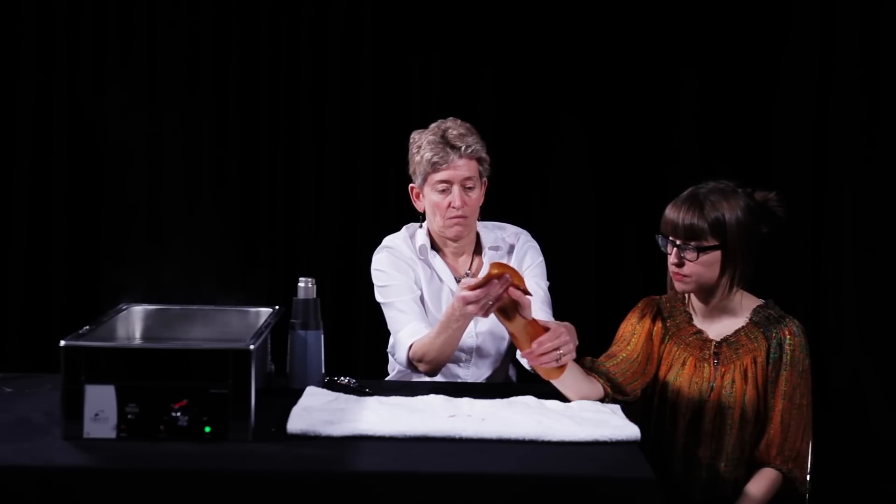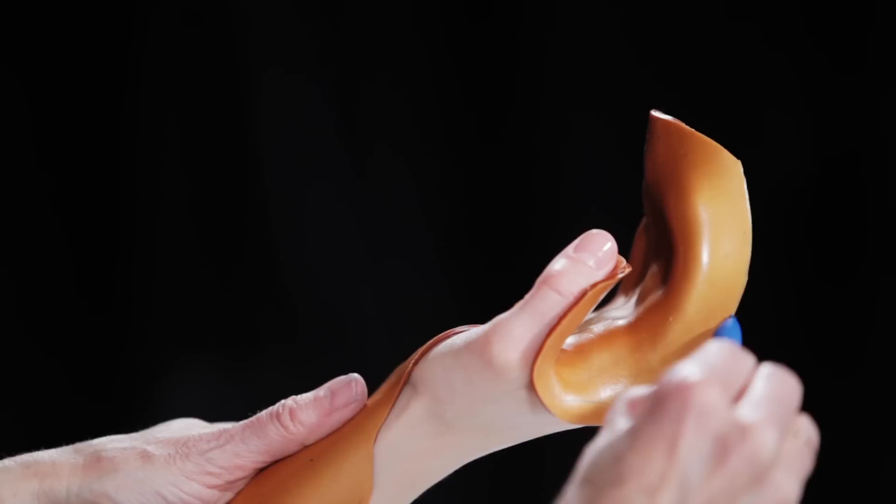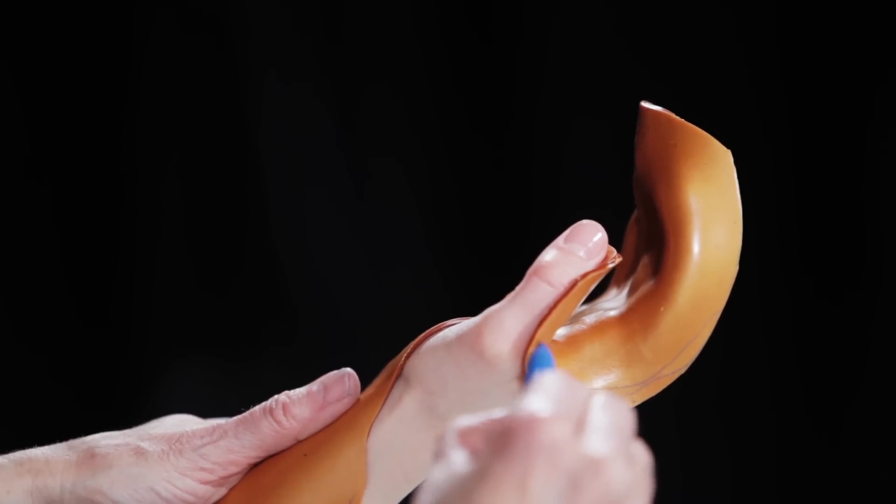Let the material harden in the desired position. Mark the trimming edges along the borders of the orthosis. This can be done both inside and outside the orthosis.